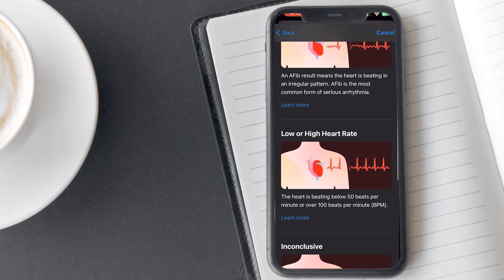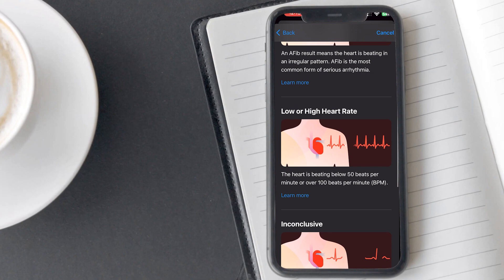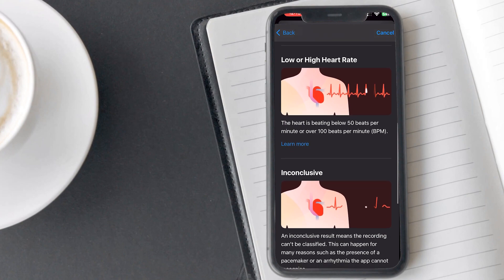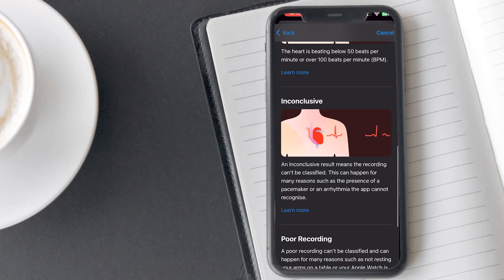If you see low heart rate, it means your heart is beating less than 50 beats per minute. And if you see high heart rate, it means your heart is beating more than 100 beats per minute. Sometimes the result may be inconclusive due to some issues or poor recording quality.